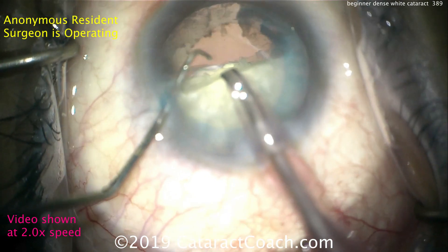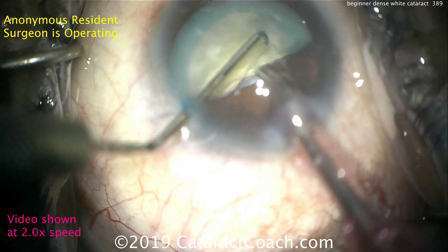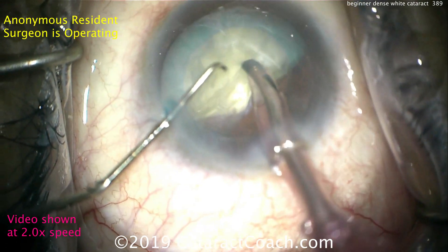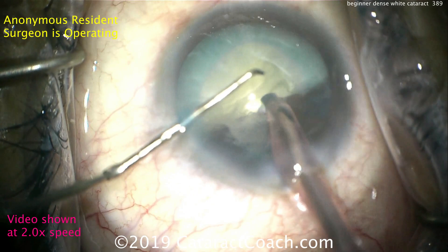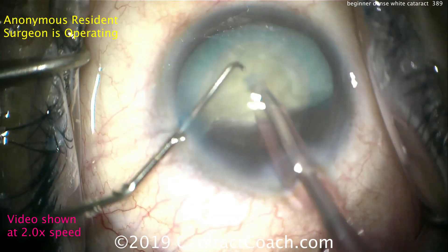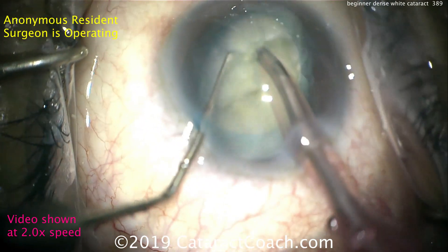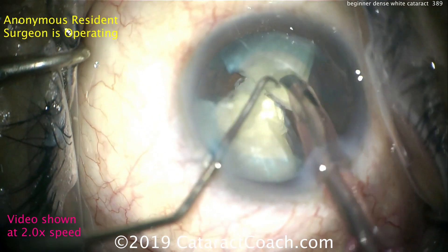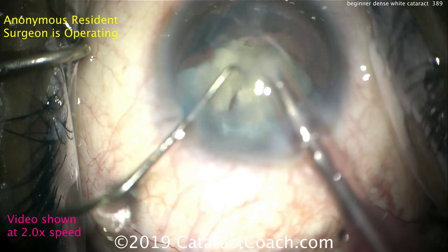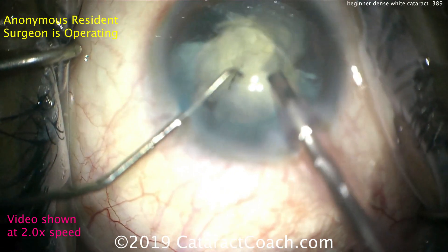That's a pretty good result for a surgeon who's just learning. Rotating the nucleus — there's a hemi-nucleus left, one half remaining. Rotate it so it's in front of the phaco probe; that's important. Buzz into it, and then it can be further sub-chopped. Buzzing in, trying a little deeper — that's better. Buzz in again and there's a good chop right there. Buzz again and another chop. This is a very nice stop-and-chop technique with a groove down the middle.